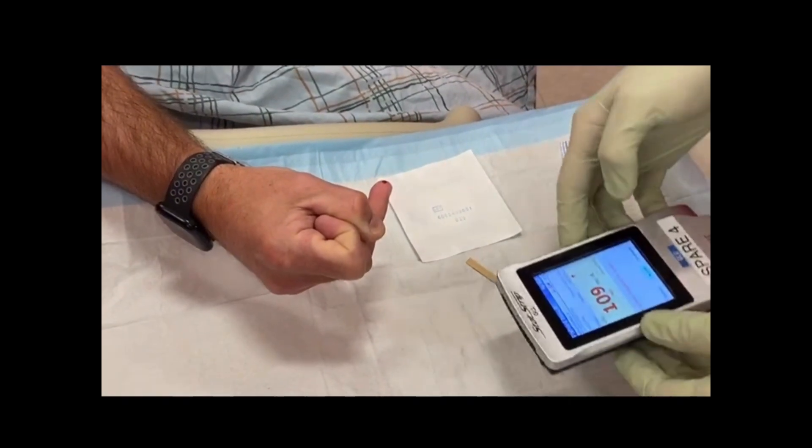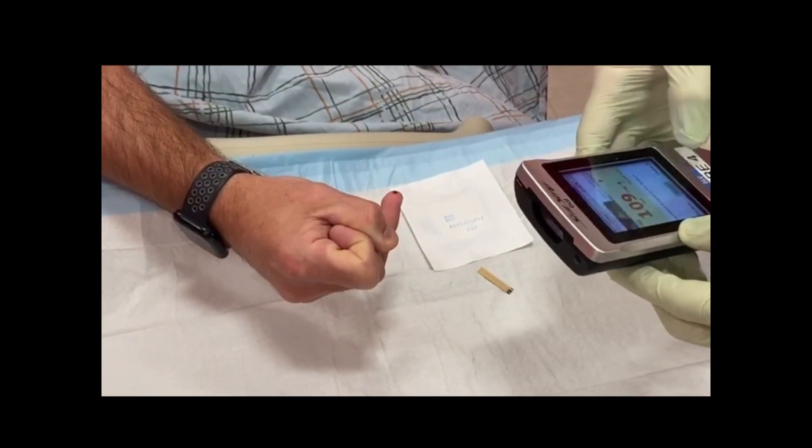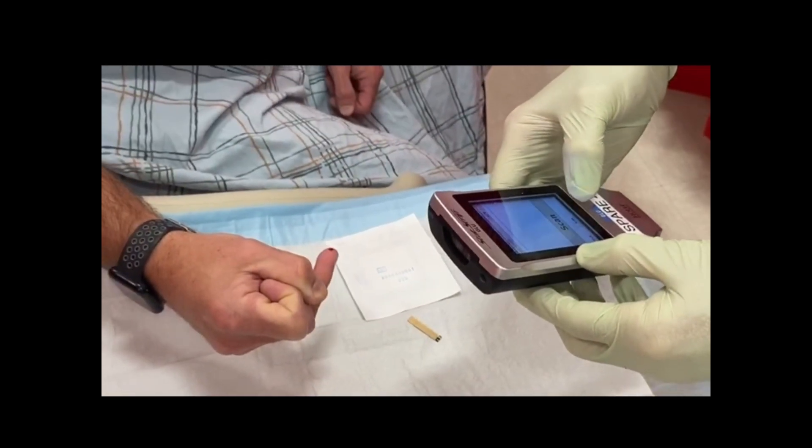Accept results and add a comment, document if needed, and report critical results according to policy.